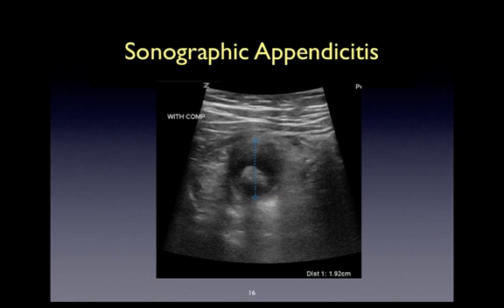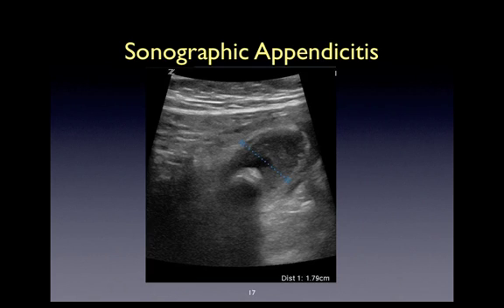This is another dramatic example of appendicitis. This appendix is measuring out at nearly 2 cm. What you can appreciate here is this golf ball-sized appendicolith, and it again maintains its structure and shape even when pressure is applied. Here's another example where you can appreciate the blind end of this appendix, again with an appendicolith noted.